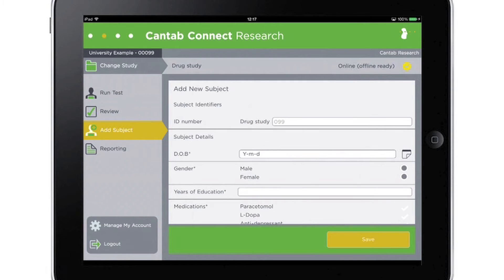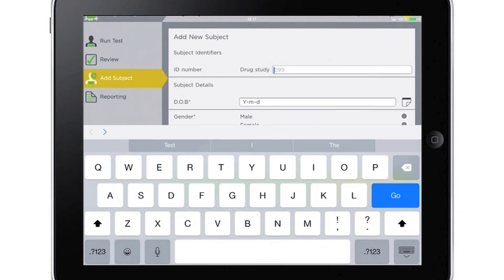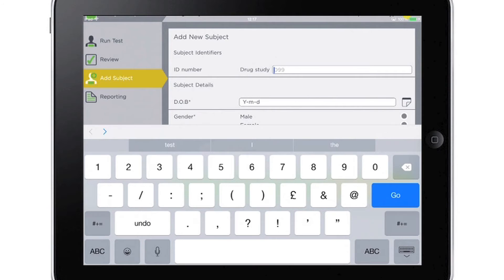To add a subject, fill out the required demographic details in the form. Once added, the subject can be tested immediately.